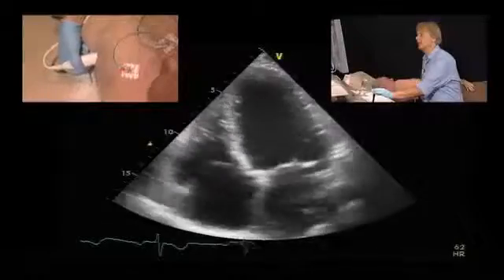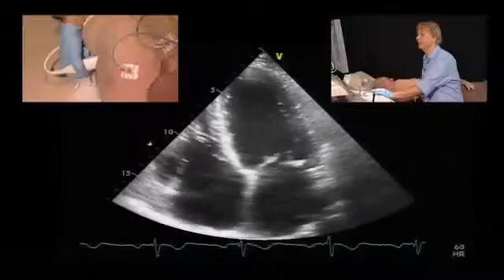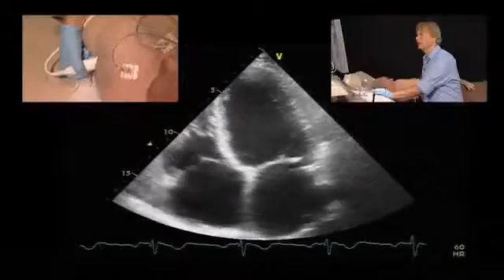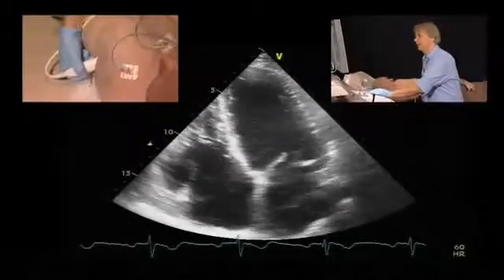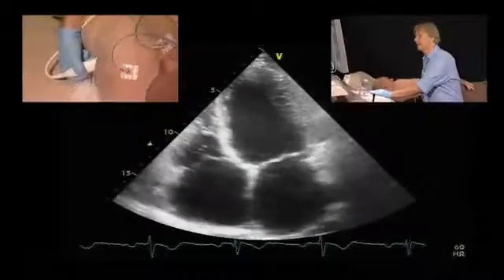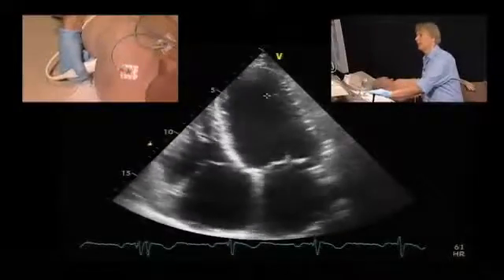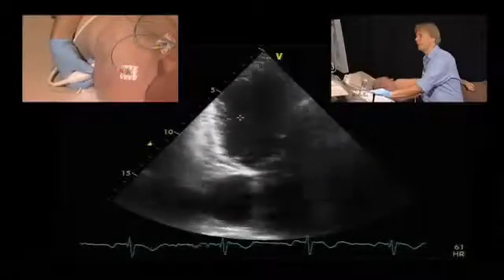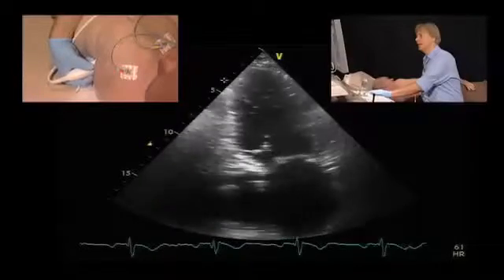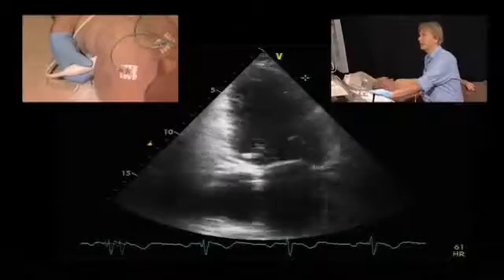However, one thing you have to also take into account is left ventricular function. If you see his left ventricle, it is significantly reduced. We have an ejection fraction of 34. We have akinesia here of the basal and parts of the mid-inferior septum. The remaining part is also hypokinetic. And we see that there's a scar also in the inferior wall. So he has coronary artery disease, and he also has hypokinesia of the remaining ventricle.